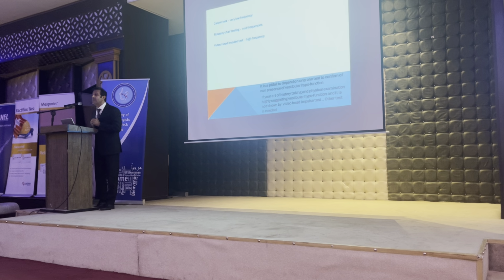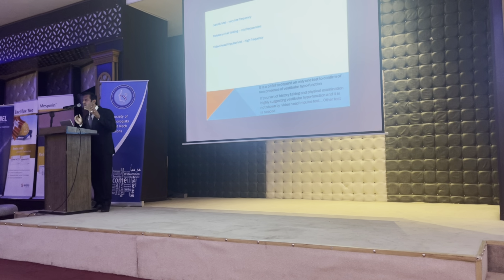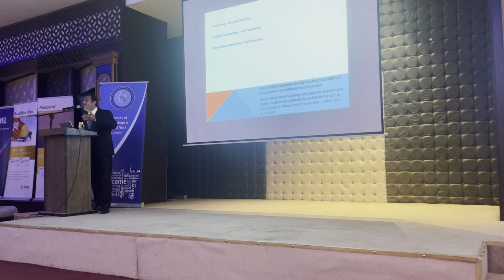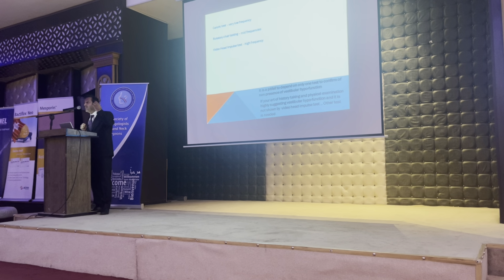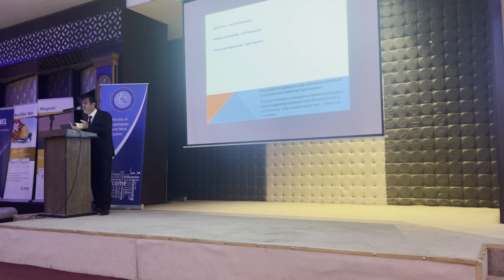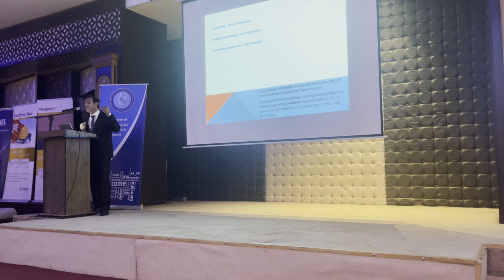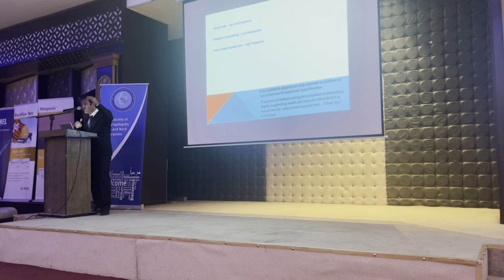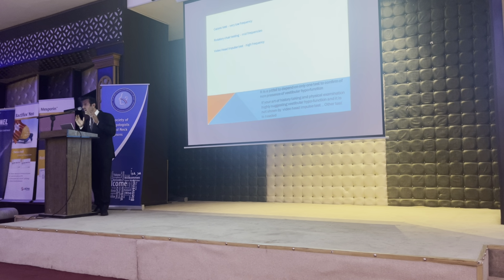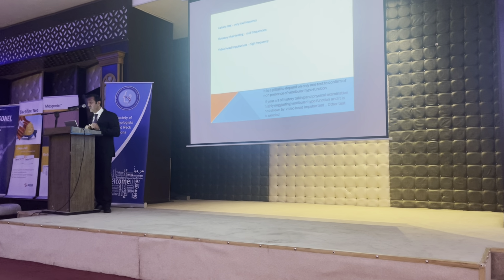What is the superiority of the caloric over the video head impulse test, in which disease? It is vestibular hypofunction, because you don't know at which frequency your patient has vestibular hypofunction. If you don't get hypofunction by head impulse test, you can get it, for example, by rotatory chair. If you don't get it with rotatory, you can proceed with caloric, because you can get, for example, a ratio difference between the gain of the VOR. It is also mandatory, needed in that scenario only.